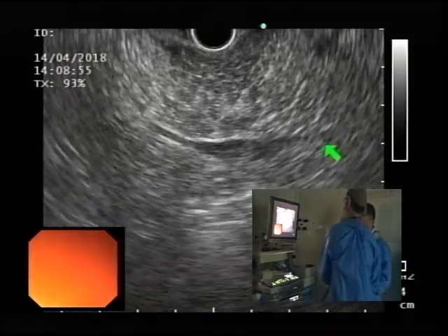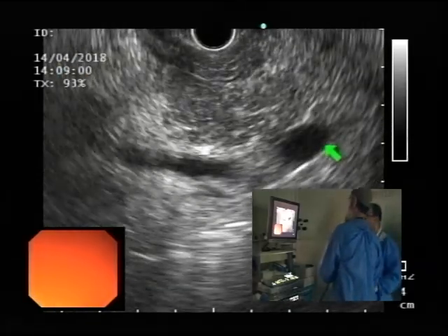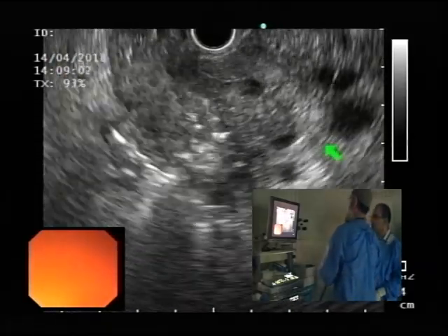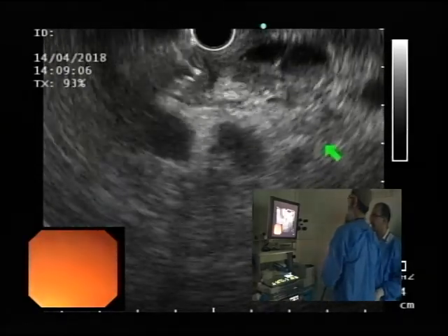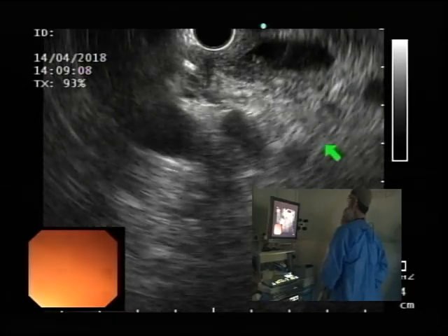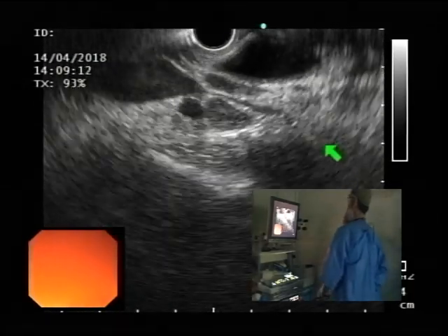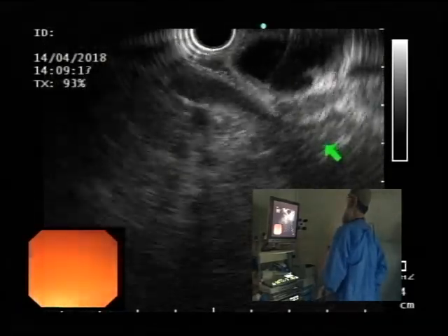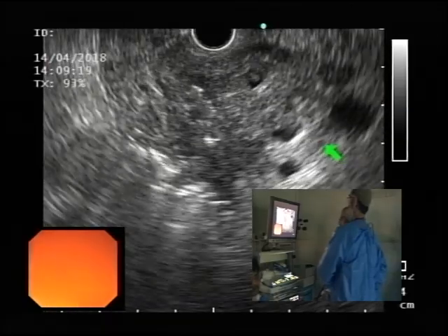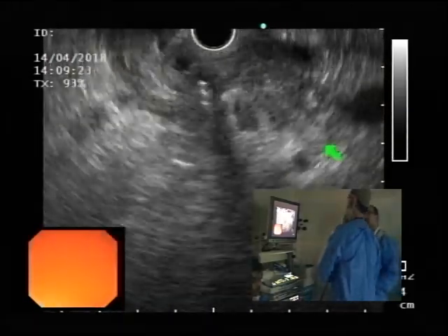You're basically sweeping against the medial wall of the duodenum. Now go counter. Pancreatic duct, keep going counter. Keep going. Bile duct. So that's it. Now pull back. Here, let me just show you. Pull back. Counter towards liver. Clockwise towards lesion. But I know you're being tentative, which is totally reasonable when you're starting out. But as you get more and more practice, you just do this faster, right?